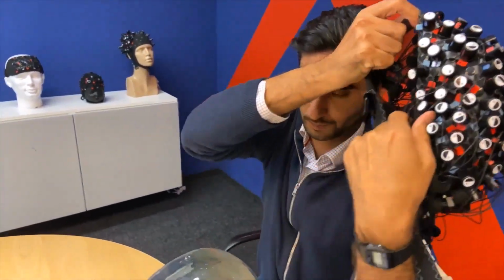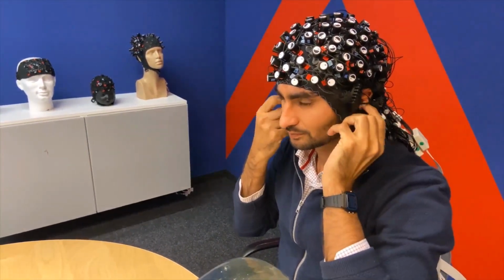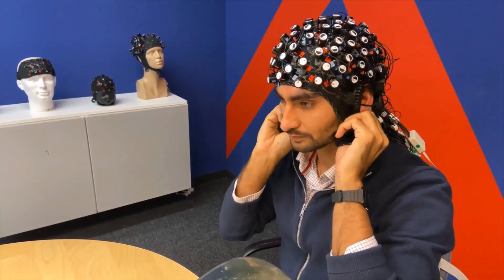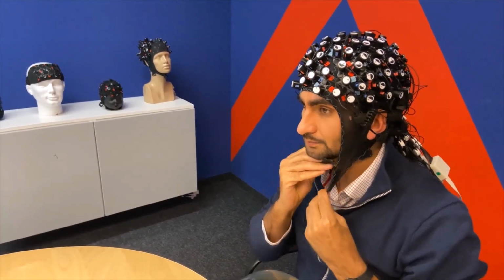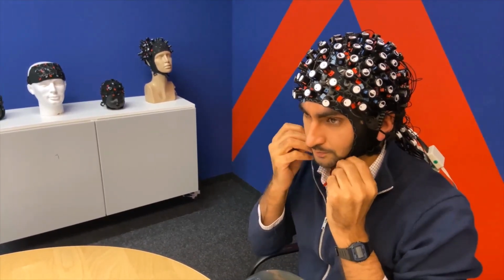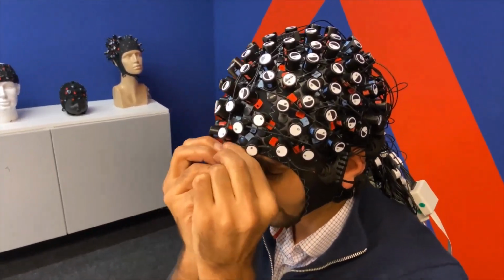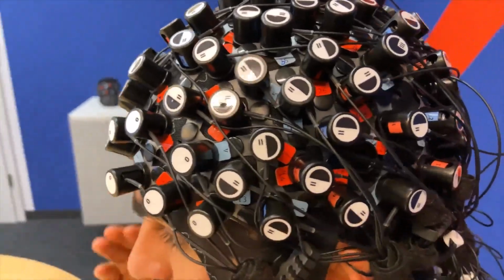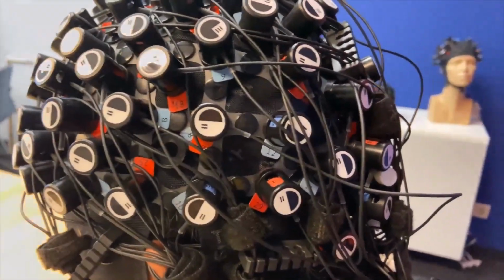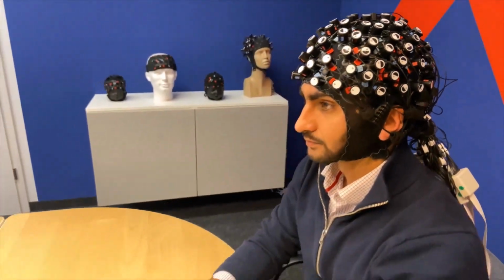Here we see the cap being placed on the participant's head. Okay, and this is our NIRS 2 imaging system, and we'll discuss that more later. So you can see it's quite a few probes, but the more probes you have, if you intersperse them with each other, you can get higher resolution imaging, and we'll talk more about that later.